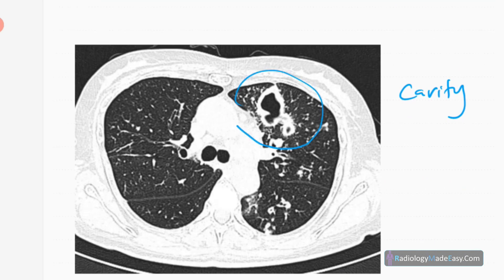Next is cavity formation on CT. You can see a cavity in the left upper lobe, mainly in the anterior segment. There are associated tree-in-bud densities suggestive of bronchiolitis. Ground-glass opacifications are also present. The tree-in-bud appearance is due to endobronchial spread of TB. Centrilobular nodules with a branching pattern are seen.